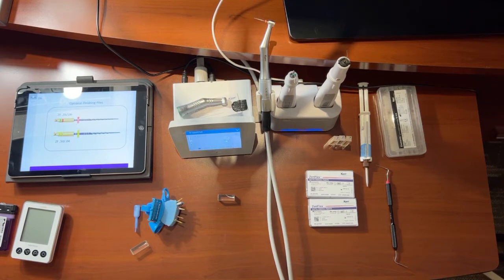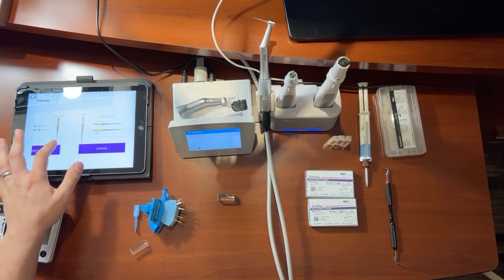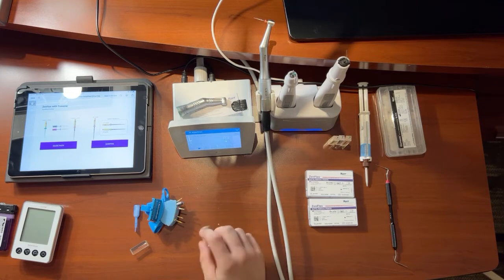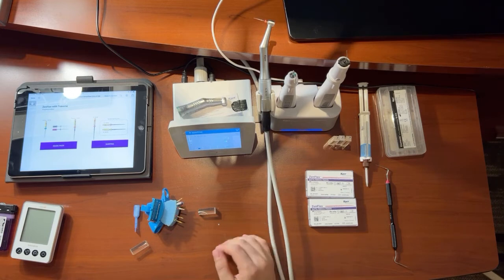And of course, between each file, I didn't mention this earlier, but between each file, you're also going to be doing the irrigation recapitulation and irrigation steps. So between each of these files, so you don't get blocked out or pack any debris apically, or just create a blockage for yourself. But yeah, so now, after you have irrigated this root canal, it is time to finish up and obturate.